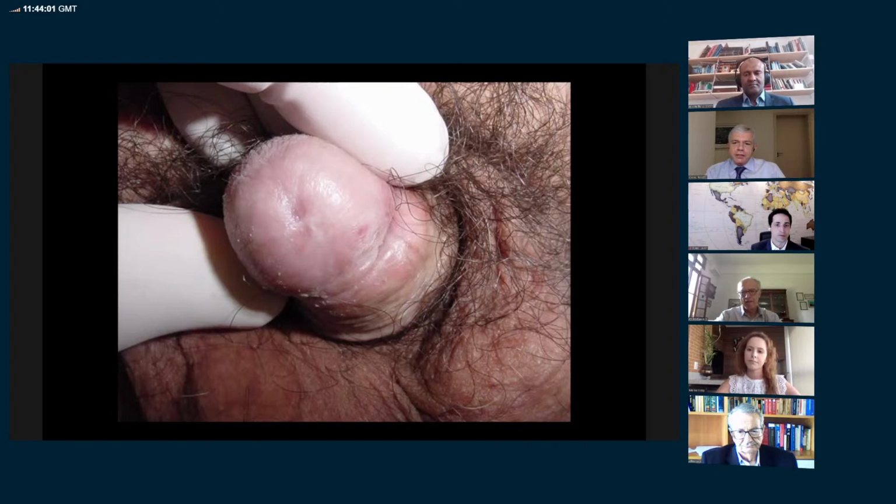Okay. Professor Nitish, about this examination, what are your hypotheses and how do you proceed now? So to me, this is quite a common case. This looks like he's had BXO, balanitis xerotica obliterans, causing obliteration of his external meatus. I'm always impressed to see that these patients can actually void, because often it's very difficult to see the meatal opening in such patients. I think this is an excellent case where ultrasound scan of the urethra would play an important role. I think it would be very difficult to get imaging by a retrograde urethrogram of the extent of the stricture disease. As you know, with BXO, you can get skip lesions, so it can affect the external meatus, then leave areas of normal urethra and then get further disease downstream.